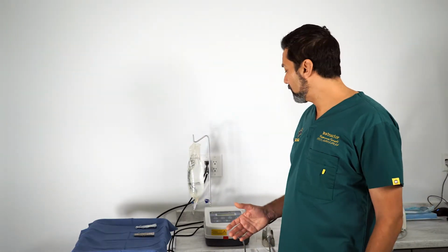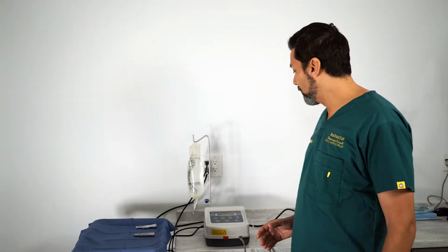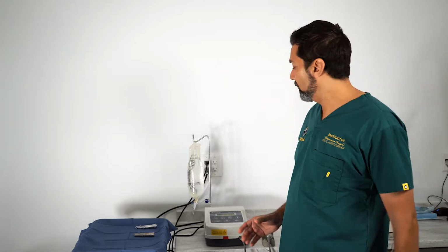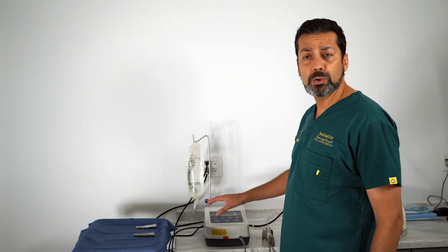So when it comes to implant motors, there are many options in the market. I personally like the X-Cube motor because it does the job and the price is very reasonable. But all of them practically have the same function. You have the saline bag that goes on a rod, you have the different settings on the implant motor that we'll go through in just a second, and you also have the foot pedal.